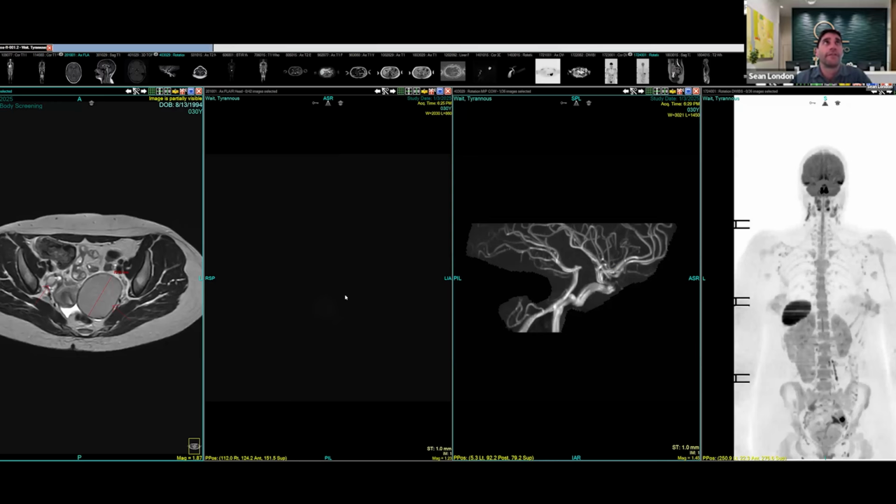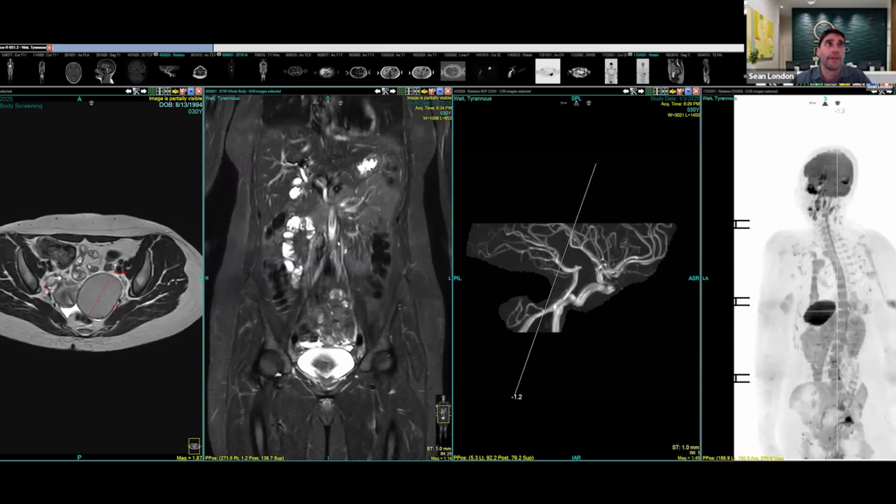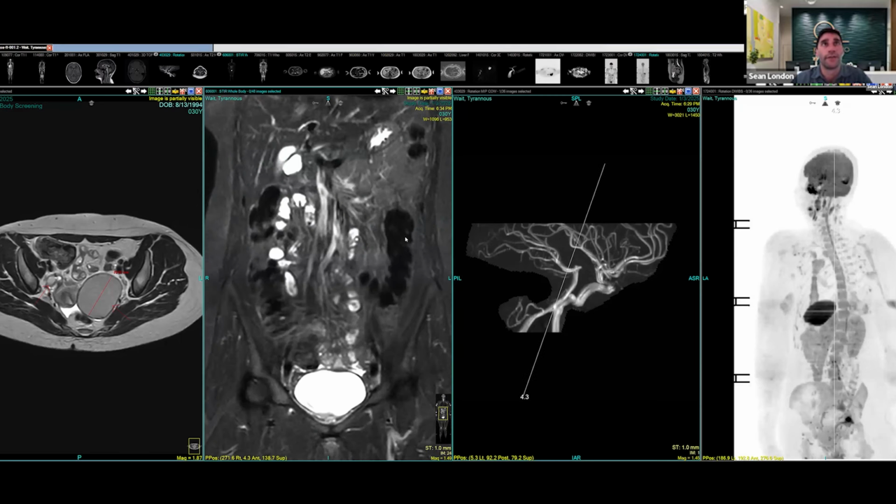For inflammatory bowel disease, often it may require a tissue diagnosis to come up with that, but we may see a typical pattern that can narrow it down. On this particular image set, this is the one that detects inflammation and fluid. Take this, for example, this is the large bowel, the colon. What I'm looking for, if there are any signs of inflammation, is wall thickening, so it would get thicker. And it would also get brighter in color. And I may even see, and often do, a bright signal adjacent to the bowel, which is also inflammation that's extended beyond the wall into the tissue adjacent to it.